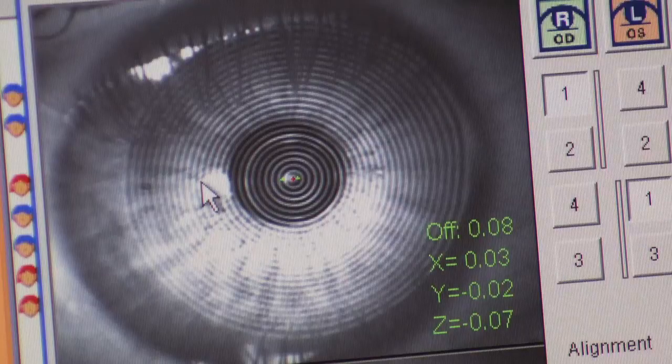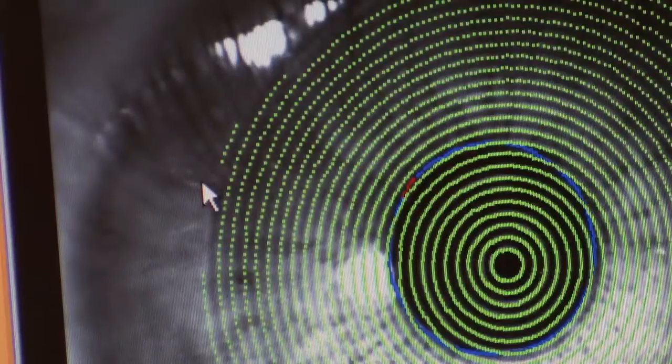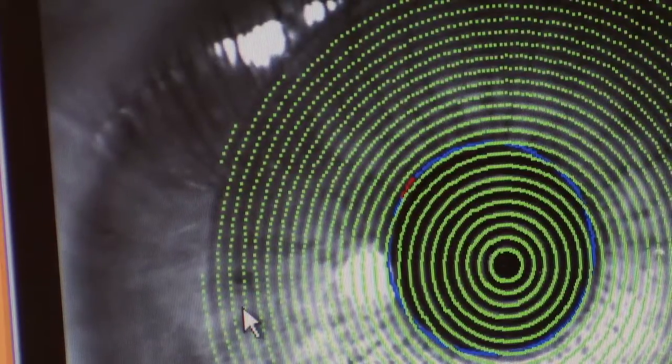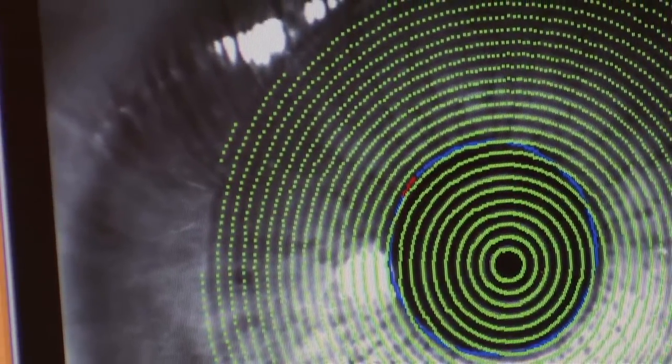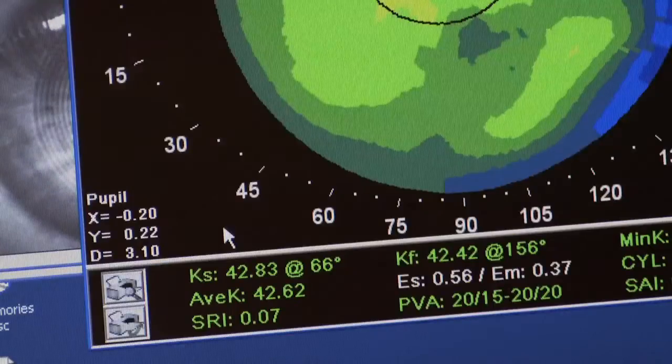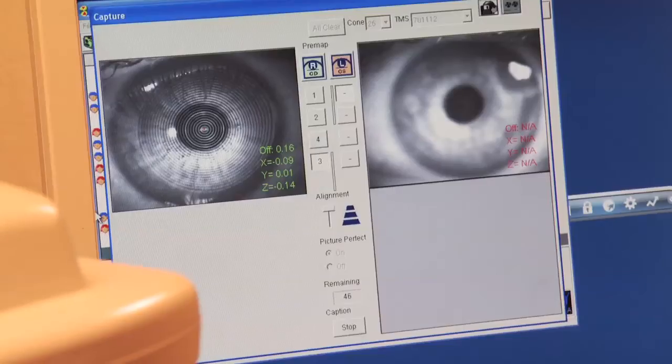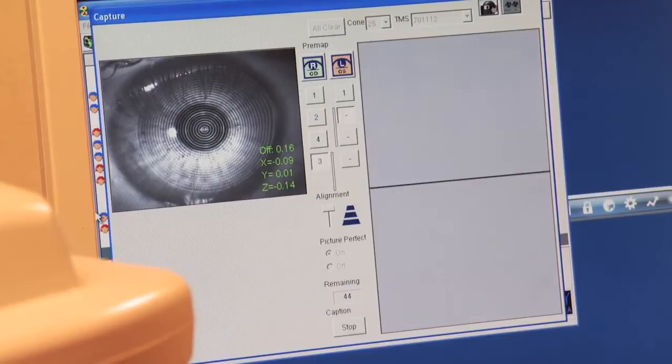Double-click the image you select to work with. A new window will appear and ask if the mires are OK. Take a look at the mires image. If the majority of the green lines are intact and it appears that you've photographed as much of the cornea as possible, select Mires OK. Repeat the same steps for the other eye.